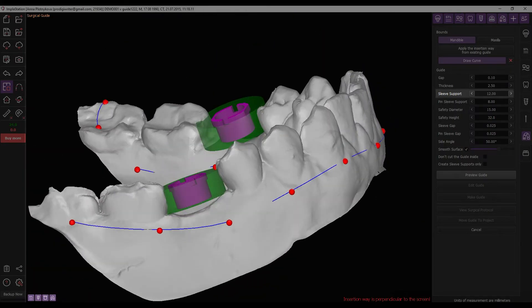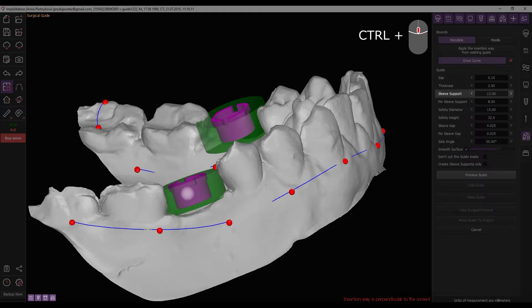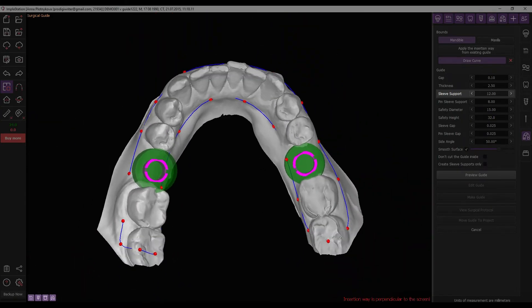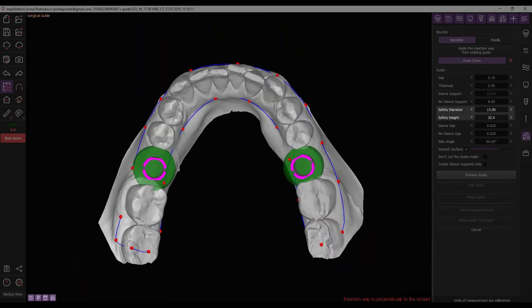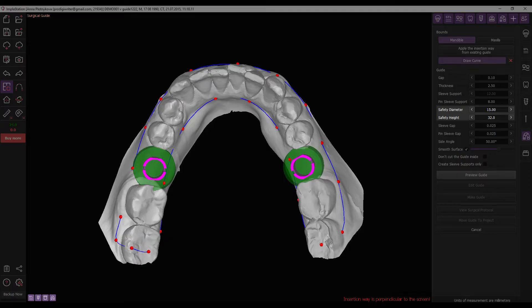Pressing CTRL while scrolling enables adjustment of the sleeve support height. Next, set the diameter and height values for the handpiece head safety zone around the sleeve. These measurements will be subtracted from the guide automatically to prevent collisions or interference with nearby structures, especially if multiple supports are nearby.